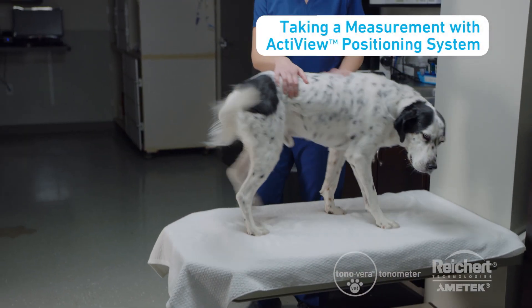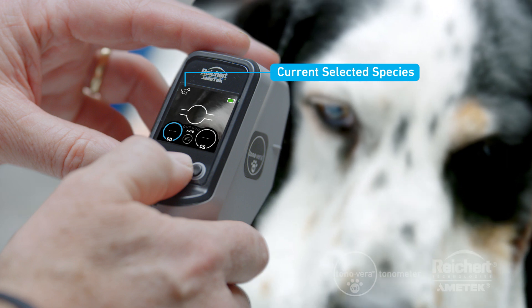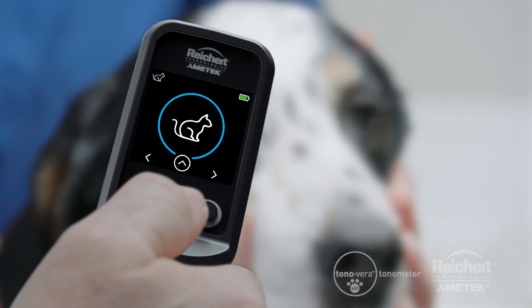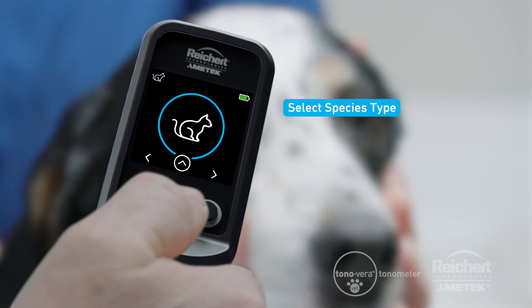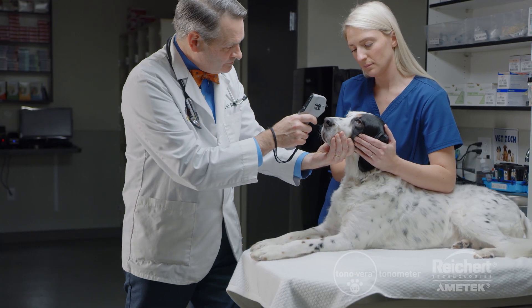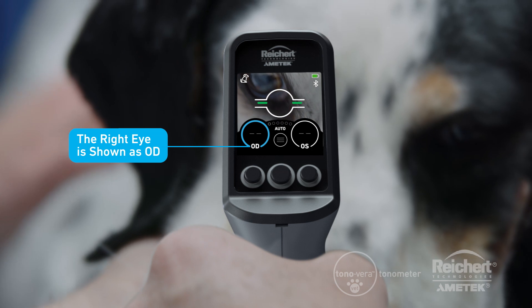Now you're ready to take a measurement using the Tanavera Vet with ActiveView positioning system. With the ActiveView positioning system, obtaining IOP measurements is fast, easy, and reliable. First, select the species you are going to measure. The current selected species appears in the top left corner of the screen. To change the current selection, simply press the center multifunction button to access the menu. The first screen that appears is the species selection screen, where you can scroll through the options: cat, horse, rabbit, or dog. Now that your species is selected, it's time to take a measurement. The on-screen ActiveView positioning system helps guide you to the apex of the cornea. The Tanavera Vet always starts measuring on the right eye, shown as OD, and a blue circle indicates the active eye currently being measured.